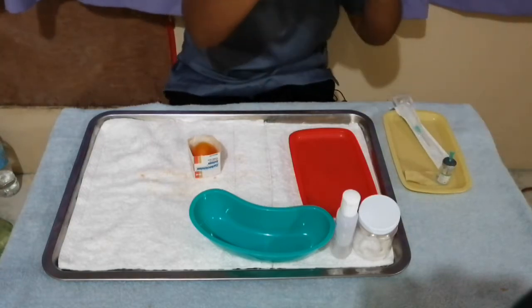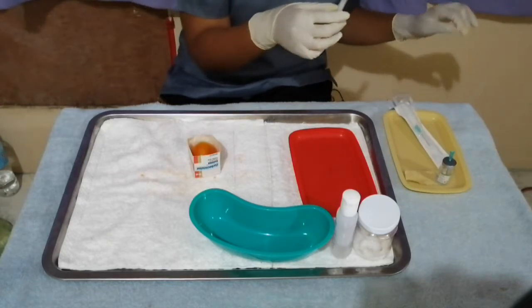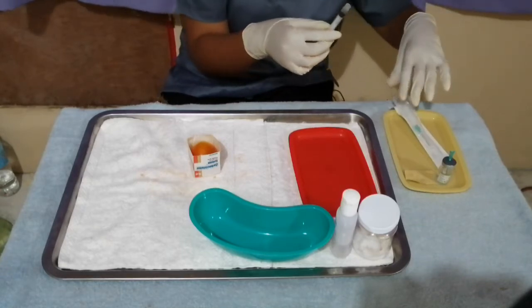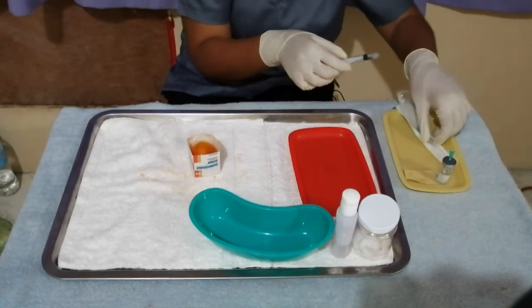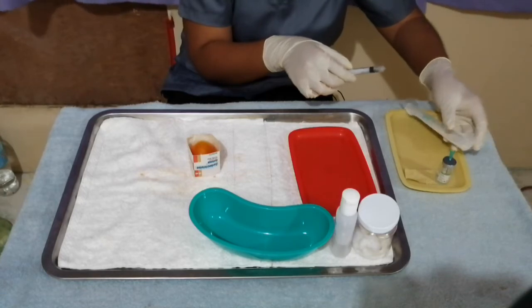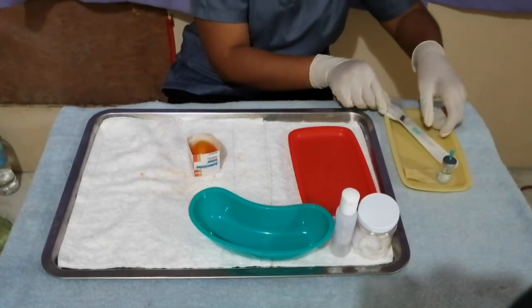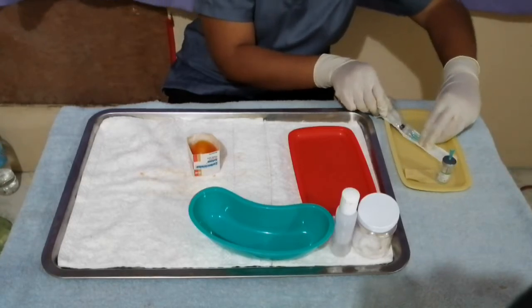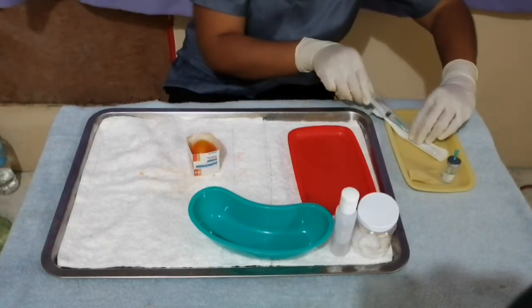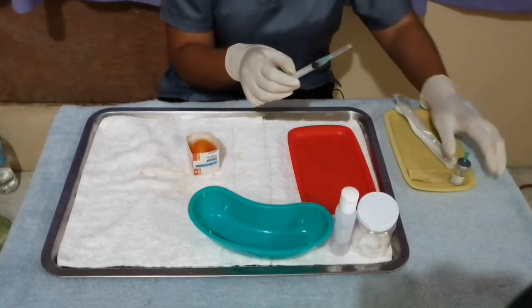Assuming that I already have the right amount of dosage for the right patient, next we're going to change the aspirating needle with the injection needle and place it on the injection tray with our medicine ticket.